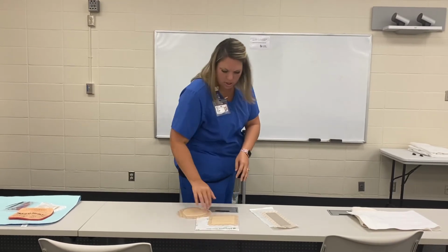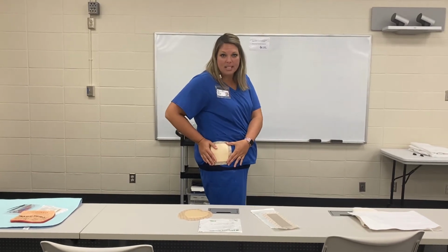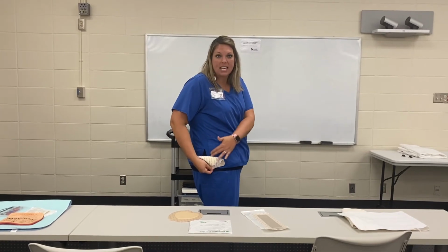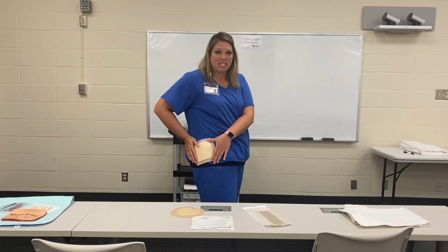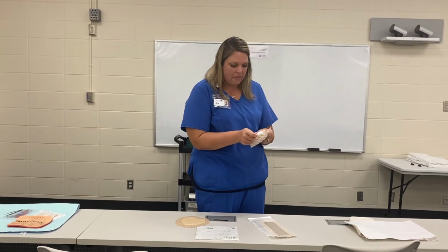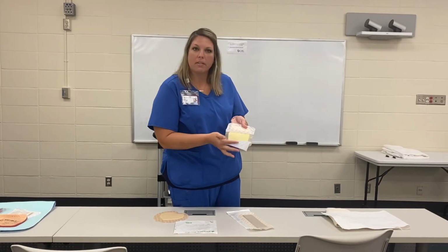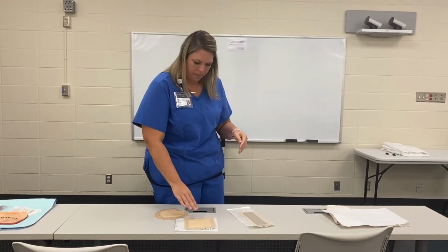If my patient has this in place, we'll just use the hip, and I go in to assess, I am responsible for peeling it back, assessing the skin under it, and then I can reapply it. That's the cool thing about it. I can reapply it, and it will be good for 7 days. Y'all are going to get to come in here and feel these, and you can even pull it off and see how it re-sticks and feel the middle of the pad that helps with pressure ulcer prevention.